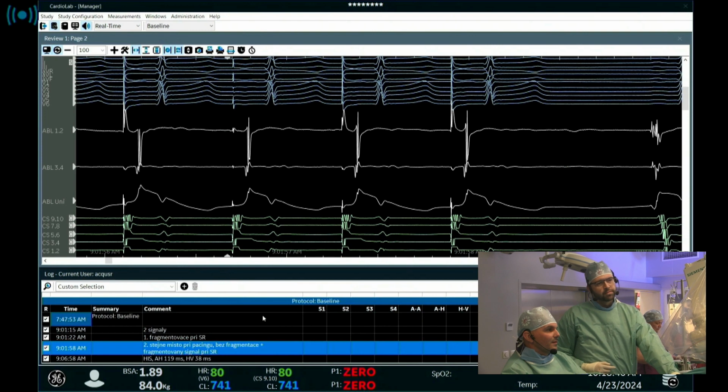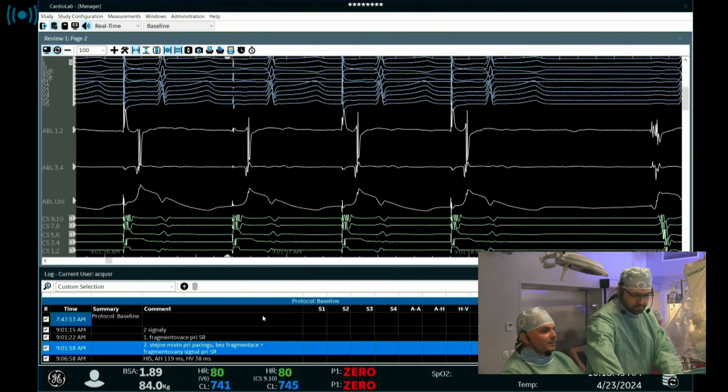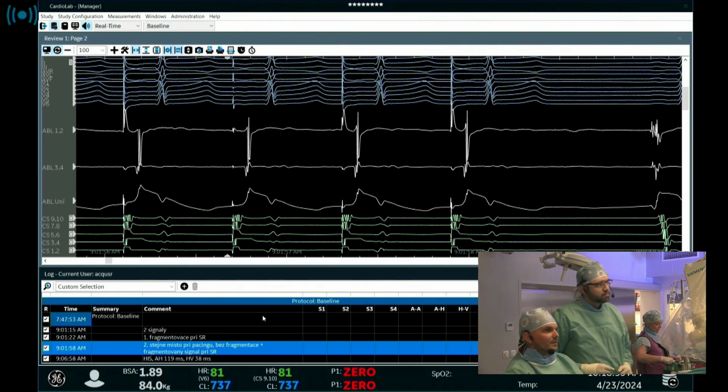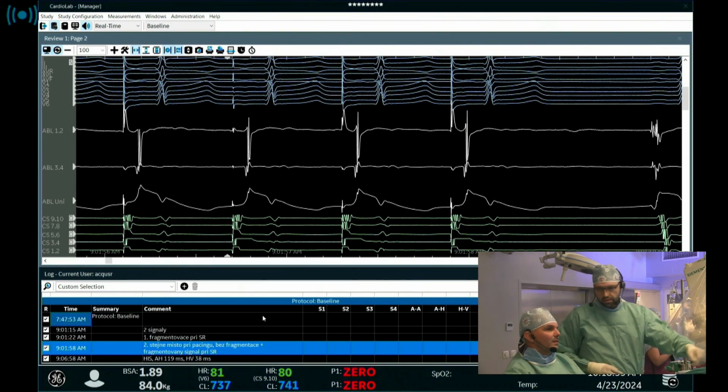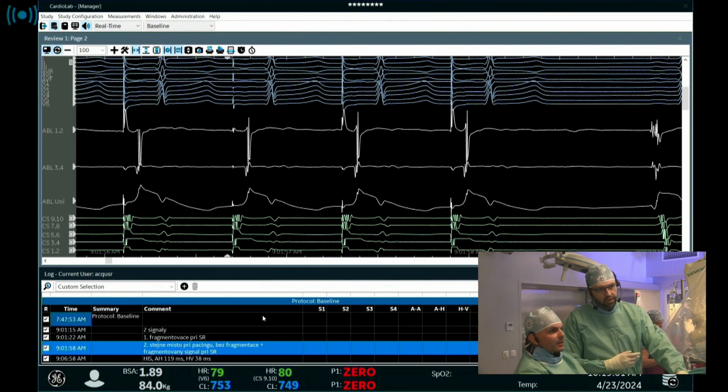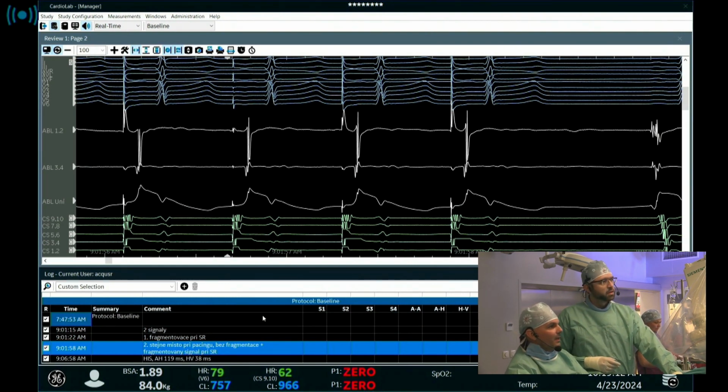But we also did studies with high frequency stimulation at these areas, and obviously when you create this vagal response, you can expect that there is a GP. But it's cumbersome to stimulate all these spots. Because they are anatomically located more or less in similar areas, you can do this empirical anatomically guided ablation.